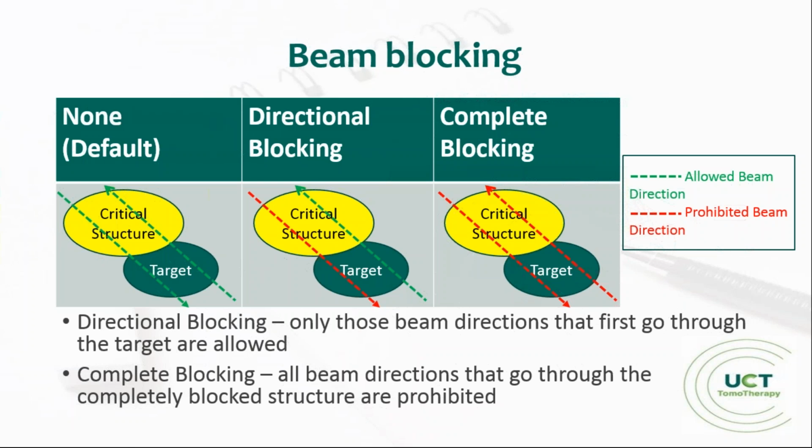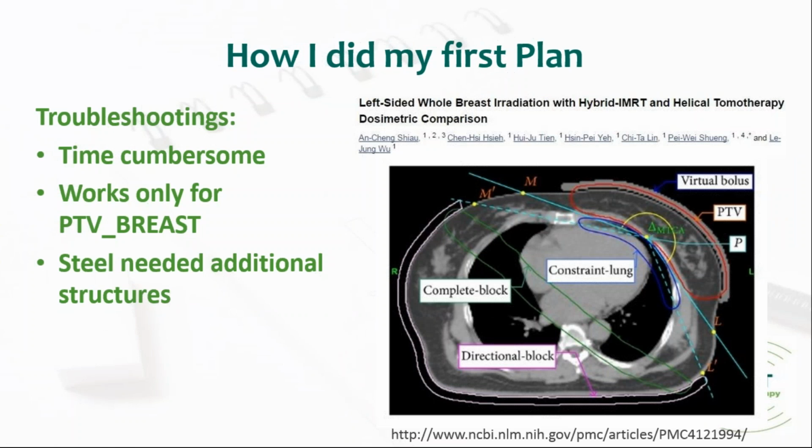So how did I do my first plan? Some time before the competition, I read this article, but I used it a little bit later.